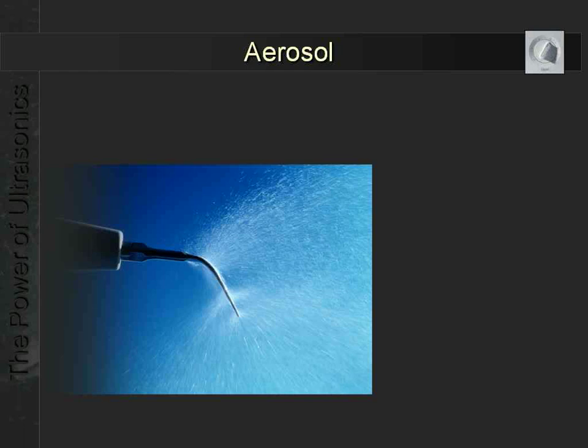But when you use an evacuator, you'd like to see a mist like this around your instrument. And what you recognize if you look at the mist is what I explained at the beginning. Where the mist is coming off, that's where there's a belly in the sound wave. This is where the knot is, and there's another knot, and this part is moving. But if you hold an evacuator close to it, you'll see the mist move this direction instead of going down.